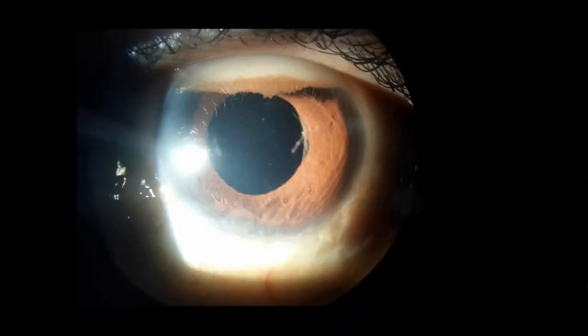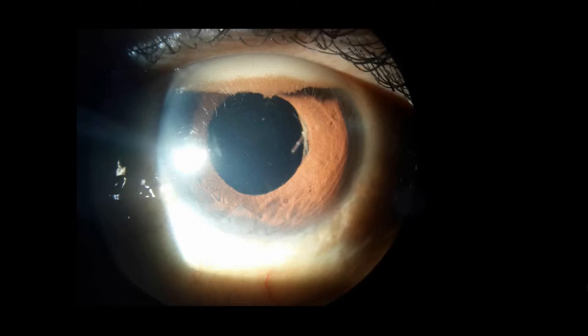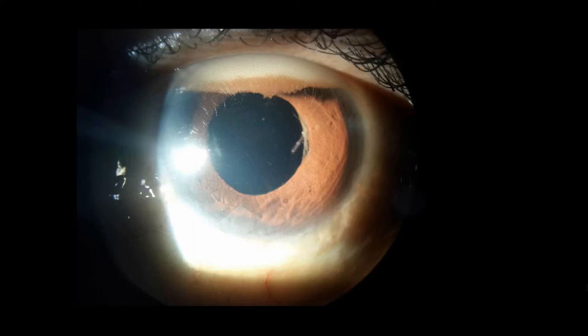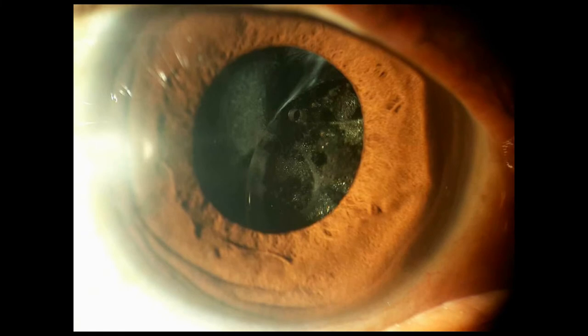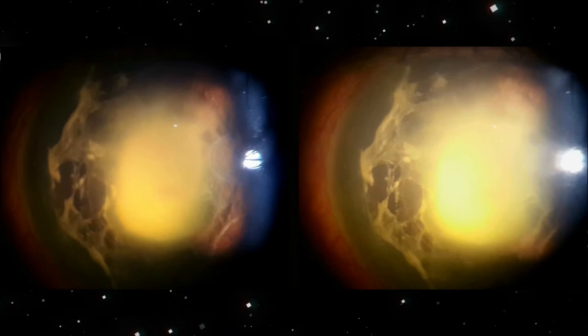This is a rare instance of hyperolion, or inverse hypopion, with pigmented emulsified silicone oil bubbles. This dislocated IOL has a few silicone oil droplets on its surface. Stereophotography is also possible, as seen in this patient with post-operative endophthalmitis. Another advantage of smartphone imaging is cost-effective video documentation.